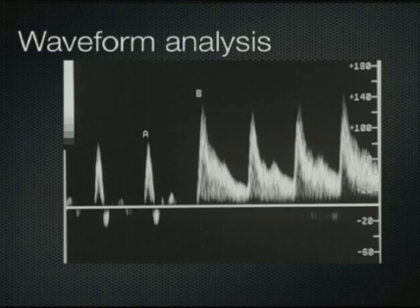When the cuff is inflated above arterial pressure, the downstream resistance is of course very high, and the arterial waveform proximal to the site of pressure application will appear as in the left-hand side of the image, a high resistance arterial waveform. If after a few moments the blood pressure cuff is suddenly released, the peripheral arterial bed is vasodilated, offering very little resistance, and the waveform changes to that shown on the right of the spectral display.